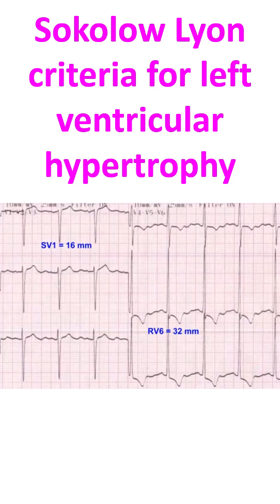Sokolov-Lyand criteria is one of the most popular voltage criteria for detection of left ventricular hypertrophy. In this ECG, we can see chest leads V1 to V6. S-Wave in V1 is 16 mm and the R-Wave in V6 is 32 mm. You can see ST depression in V5 and V6 along with T-Wave inversion in V4, V5 and V6. These are features of left ventricular hypertrophy.